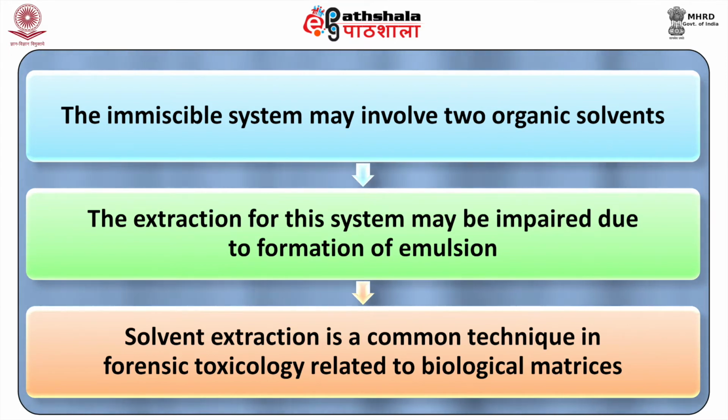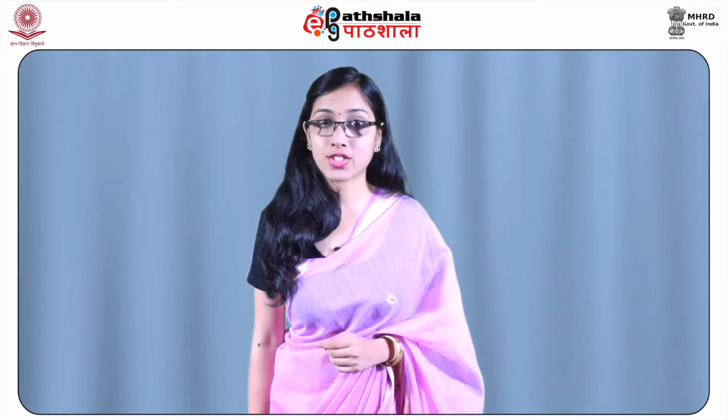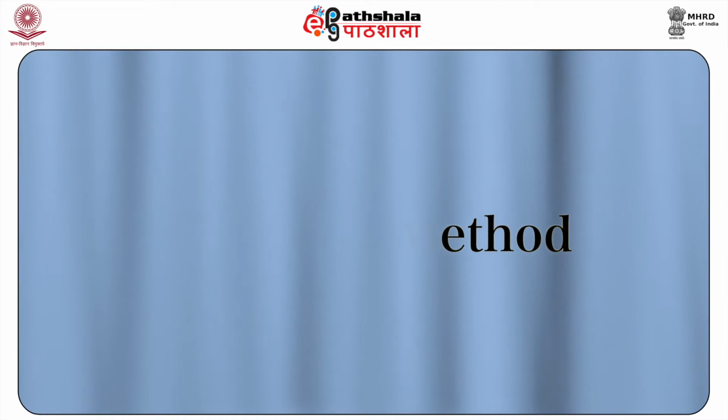Solvent extraction is a common technique in forensic toxicology related to the biological matrices. Solvent extraction method has now been upgraded and made automated, that is the accelerated solvent extraction technique, or better known as ASE. In case of solid non-biological matrices, continuous extraction by a Soxhlet may be employed, that is continuous extraction. Third process is the digestion method.